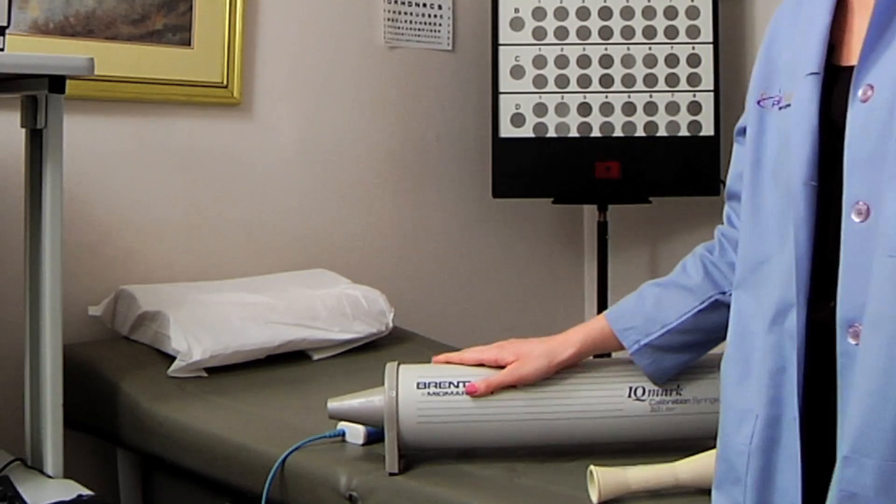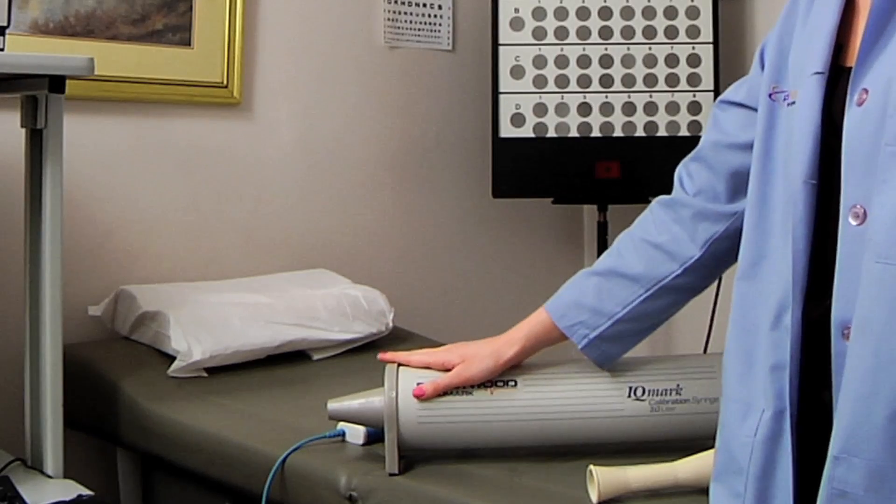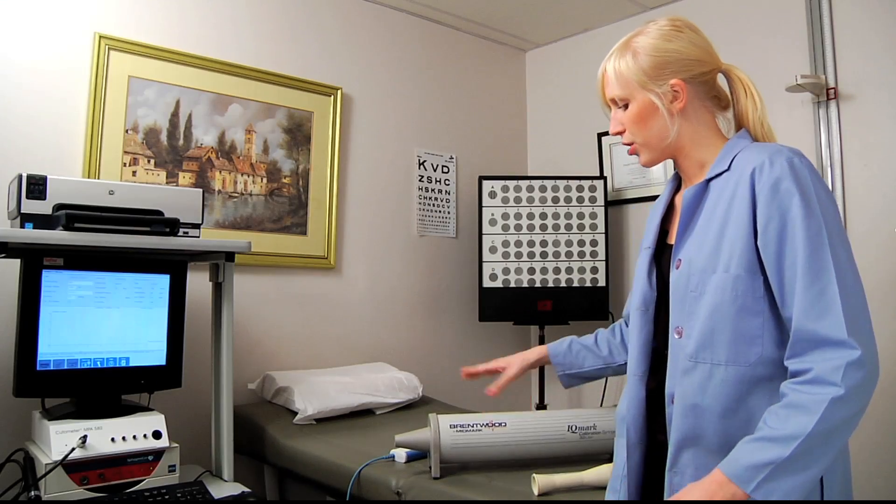The other thing you'll notice is this big calibration syringe. This is what we're going to use to perform the test. The idea is that it's supposed to mimic the lungs.